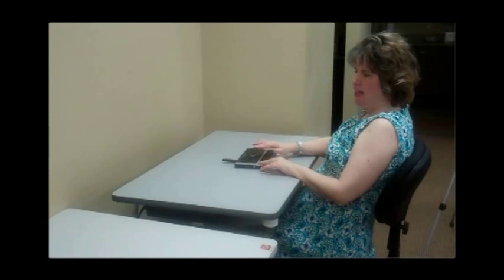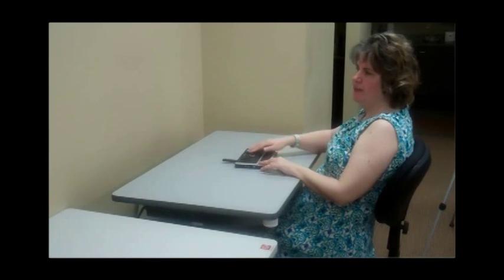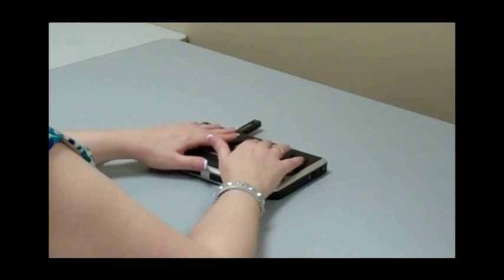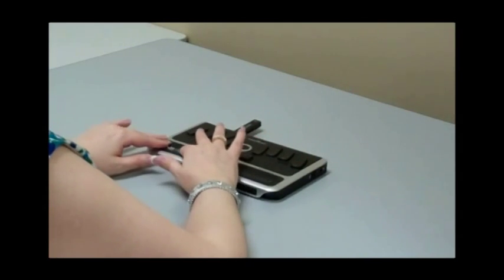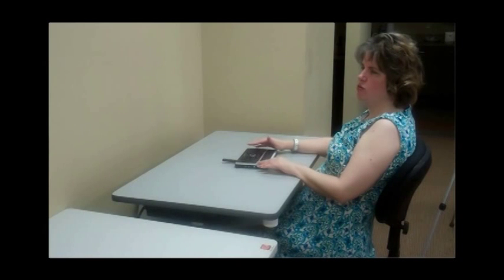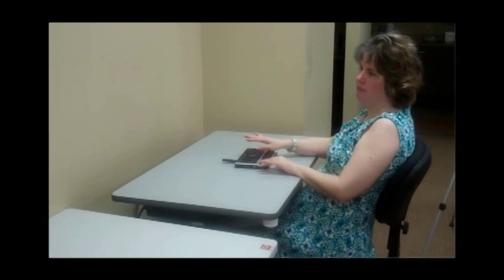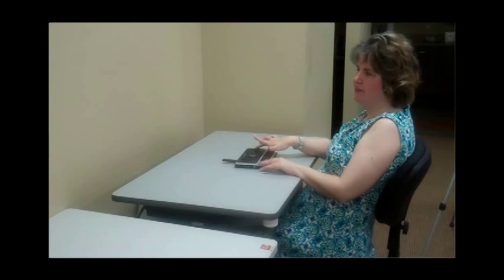Main menu. And I'll just briefly show you one more thing. I could go on all day. It's a fantastic piece of equipment. I'm going to show you the address list. I'm going to hit the letter A. List menu. And that takes us to the address list application, which is called the key list. That takes us to that menu. Add address. And we're going to add an address. So I'm going to press enter.